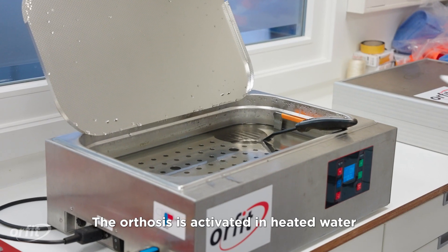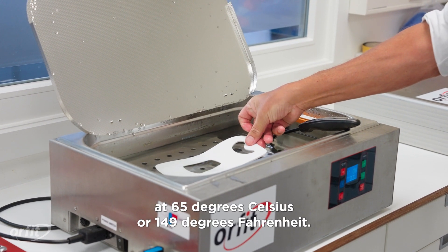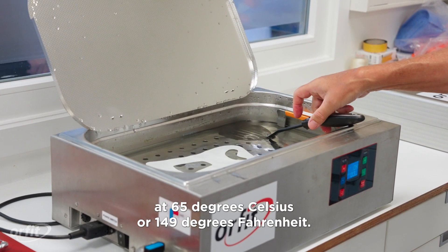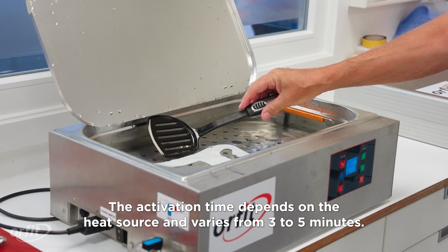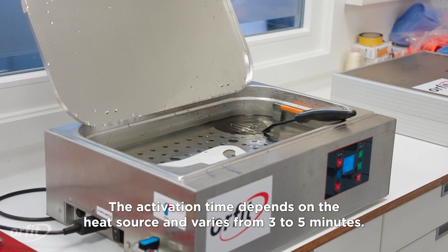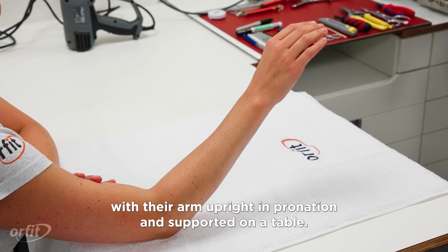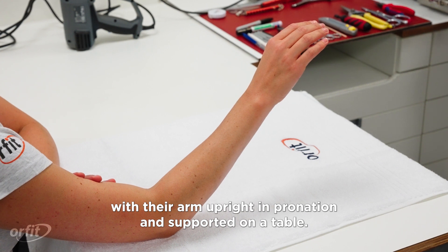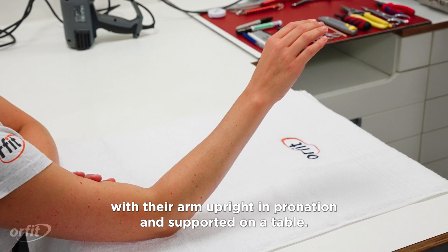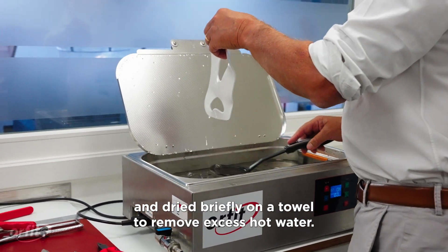The orthosis is activated in heated water at 65 degrees Celsius or 149 degrees Fahrenheit. The activation time depends on the heat source and varies from three to five minutes. Have the patient ready with their arm upright in pronation and supported on a table.